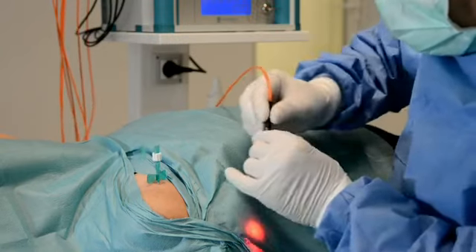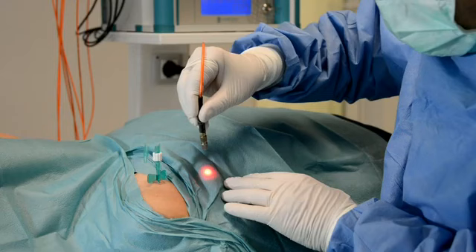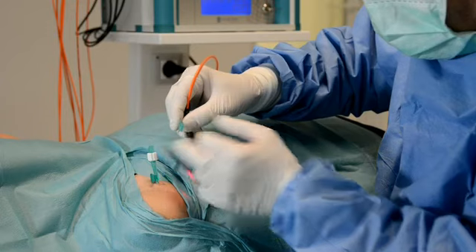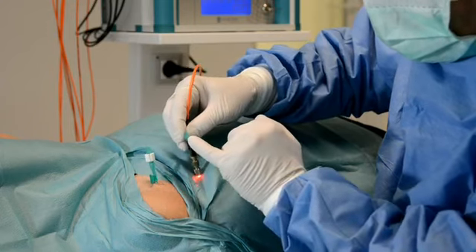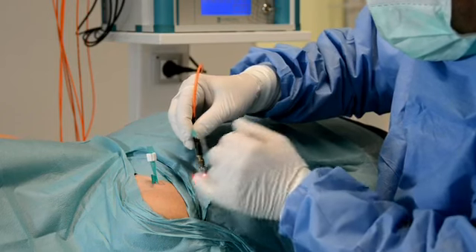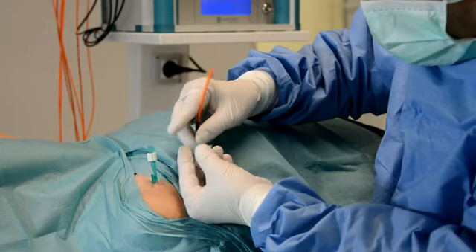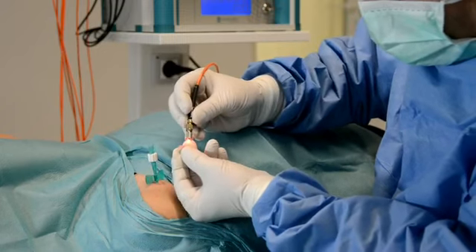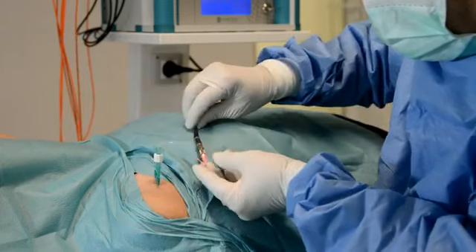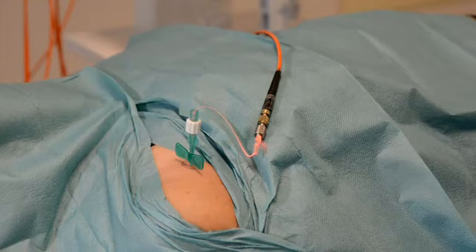We now connect the fiber optic cable coming from the model of the laser device with the adapter to the fiber optics of the catheter. So the connection is ready, and we can see immediately the transfer of the light to the inflamed area. So the system is working now. And if we switch the light on and off, we can see how the light is coming back from our treated area.